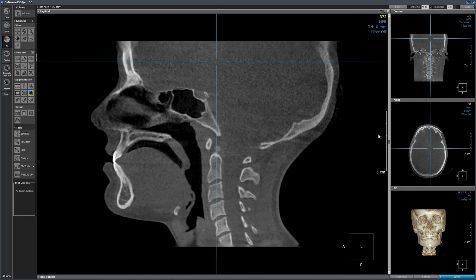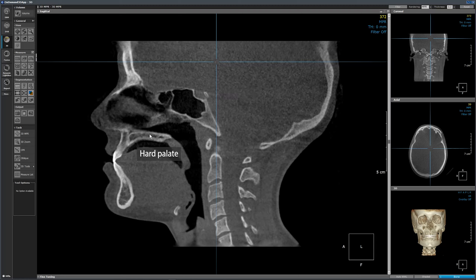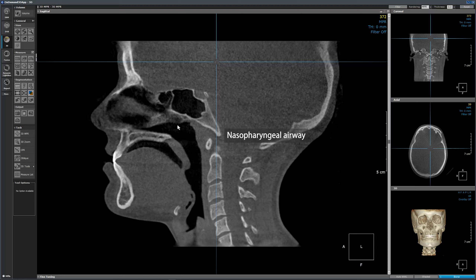At the midline of the head, we have several more structures we can recognize. This is the sphenoid sinus. Superior to the sphenoid sinus, we have the sella turcica. We are seeing the hard palate and with the hard palate we see the soft palate. This is the dorsum of the tongue. If you draw a line from the hard palate to the distal aspect of the pharynx, this area is the nasopharyngeal airway. From the hard palate down is the oropharyngeal airway.